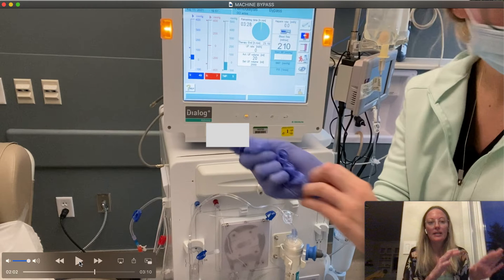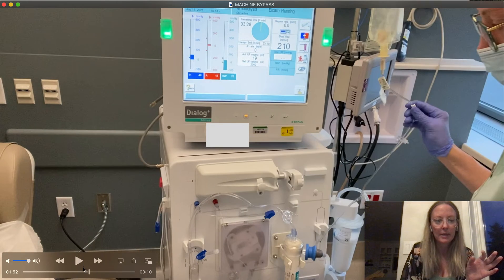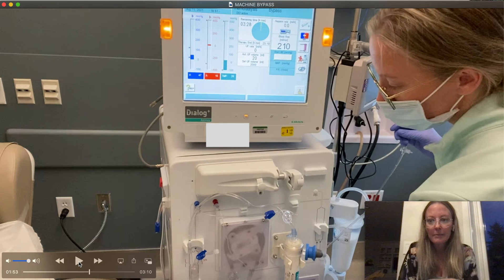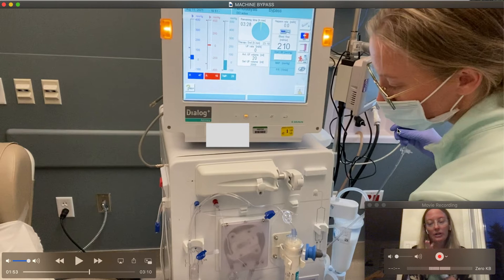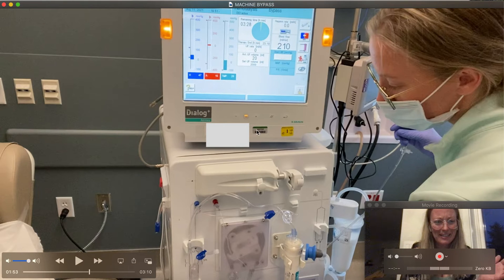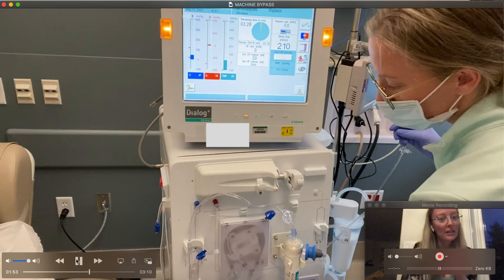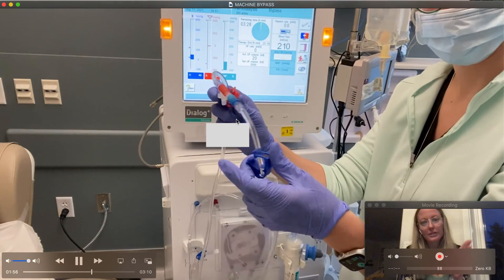They're back from the bathroom, sitting in the chair and ready to get started. I'm now clamping all four clamps — all four clamps need to be clamped. One of the most common mistakes is people forget to clamp the saline, and then you hook them up and end up giving them a liter of saline to a dialysis patient. You only have to do that once and then you will learn. So I'm clamping all four: one, two, three, four.